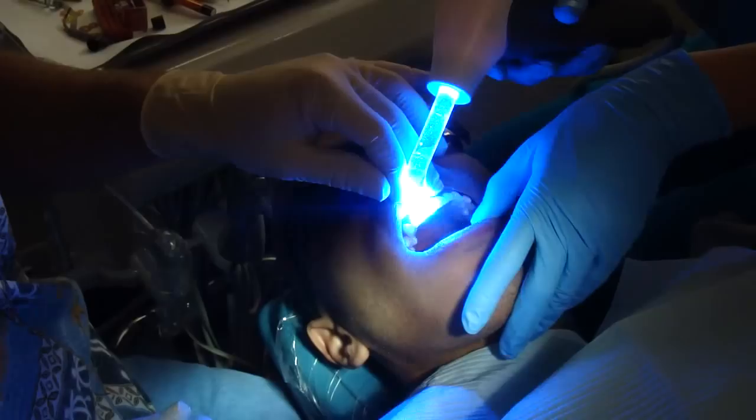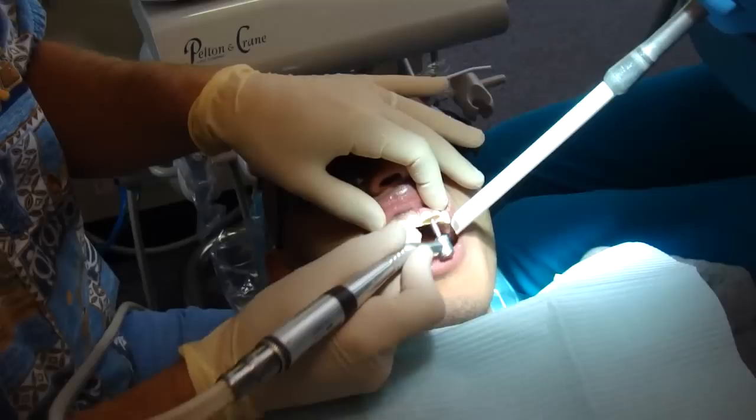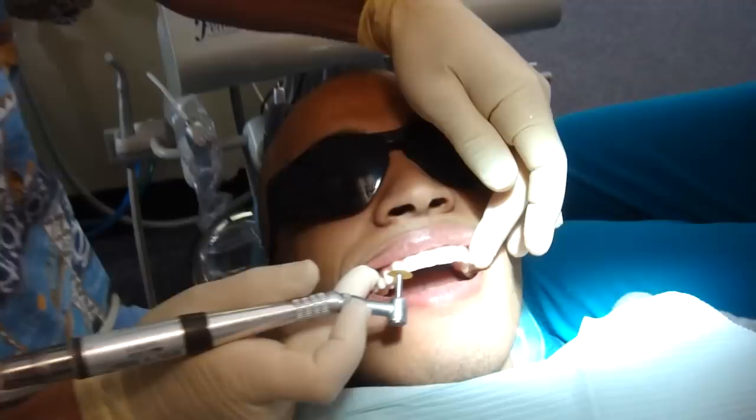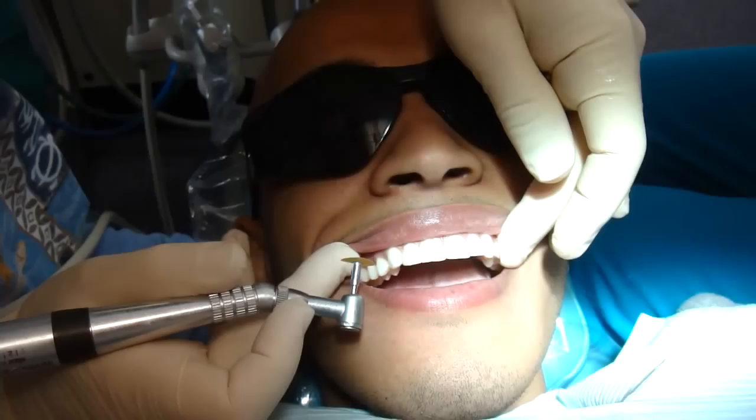We'll polish and check the bite. So we're just putting the final polishing touches on the temporary veneers. So that's it — we've closed this space. They'll be a lot nicer with the permanent veneers, which are made out of porcelain, but this will look nice in the interim while we're waiting for the porcelain ones. I'm going to try your veneers in and see how they fit and how they look.